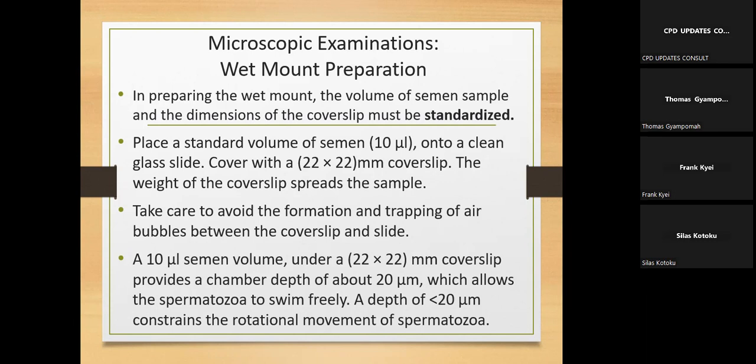If you do your wet mount very well, you get good information about a lot of things about the sperms. This is all that we're talking about. I hope you followed it. Good.